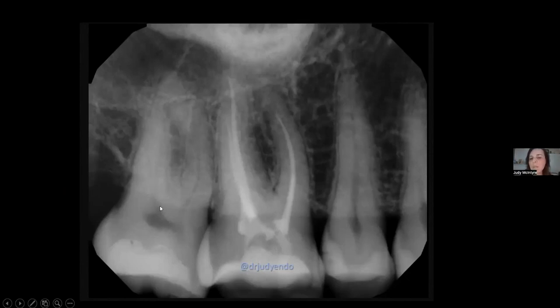So what I really want to take a moment to convey is I'm putting everything together, clinically: what I see with my eyeballs, what I find with my tests, my 2D images, as well as 3D, and then informing the patient the best we can. And not every patient wants to save even the minimal ones. And the minimal ones also not always can be saved due to time or resources of the patient, and vice versa. Some of the major angular defects the patient wants to save and we can't.